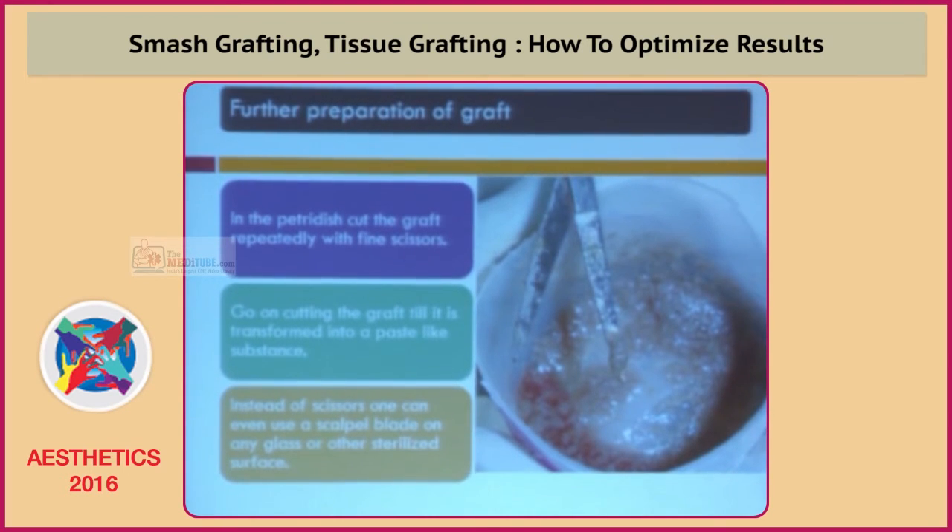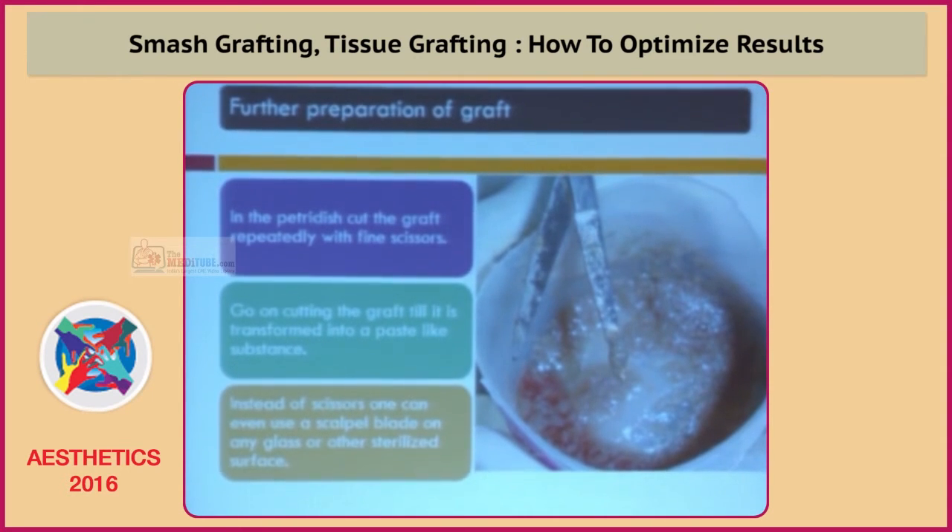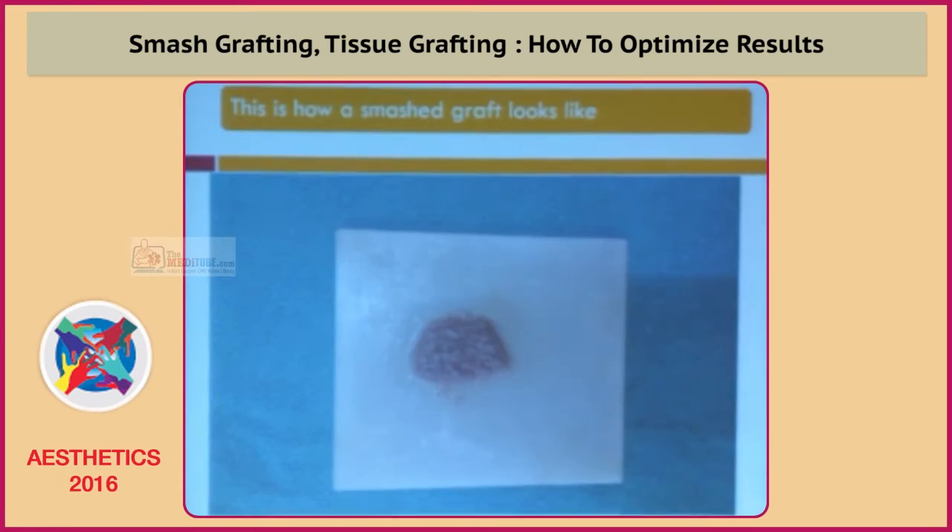Instead of scissors, you can also use scalpel blades. If you have a glass surface, you can use scalpel blades and cut the graft into very small pieces. This is how a smash graft looks — it is a paste-like substance prepared on a glass surface.